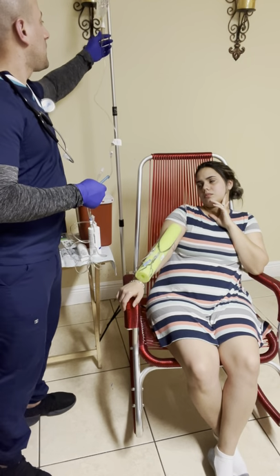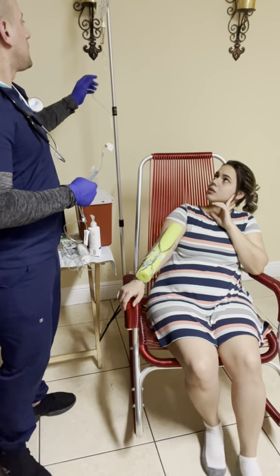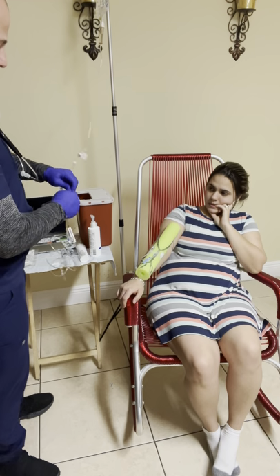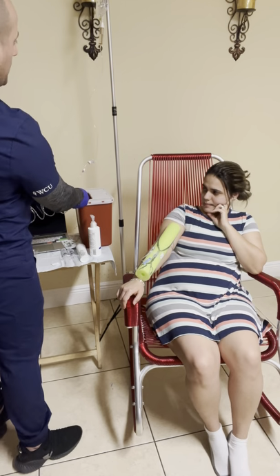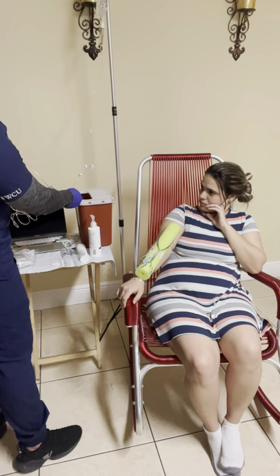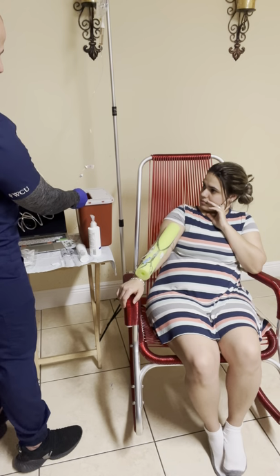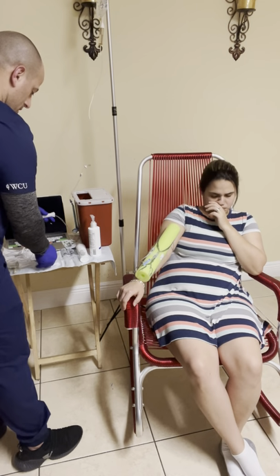I'm going to squeeze the chamber and open the clamp. I'm going to see slowly the solution coming through the IV line, slowly to avoid air into the line. Perfect.